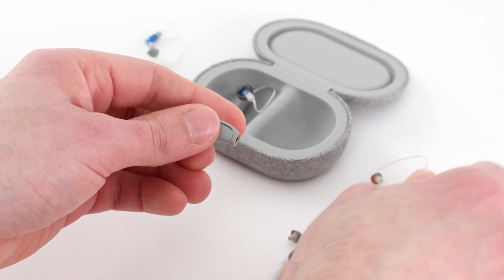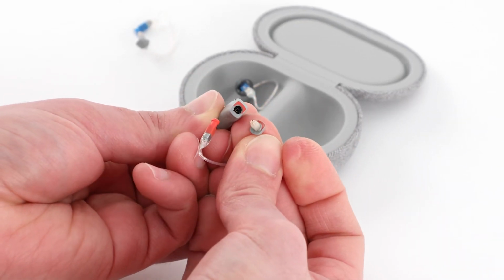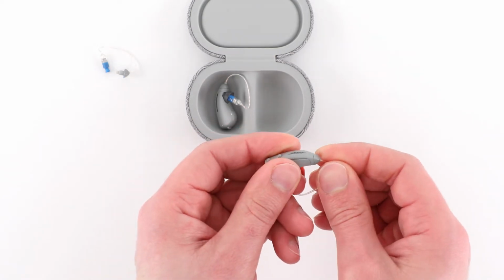Select the new cable with the same color speaker as the old cable. Align the end of the new cable with the port on the hearing aid body so the color marks line up. Insert the cable into the hearing aid until you hear or feel a click.